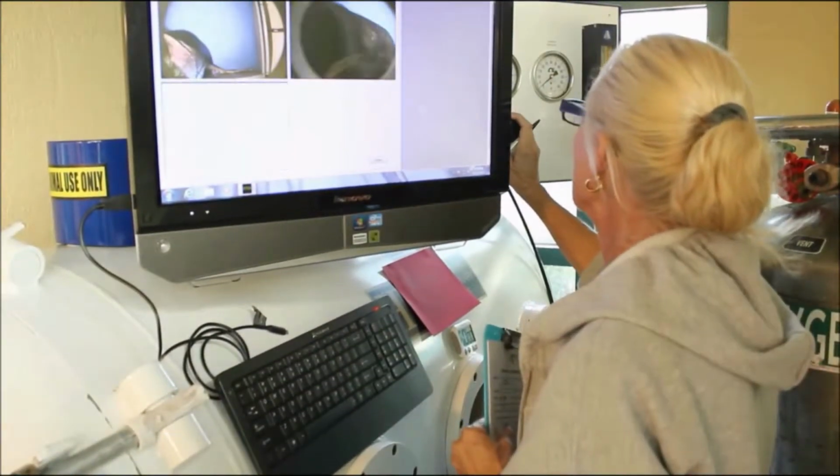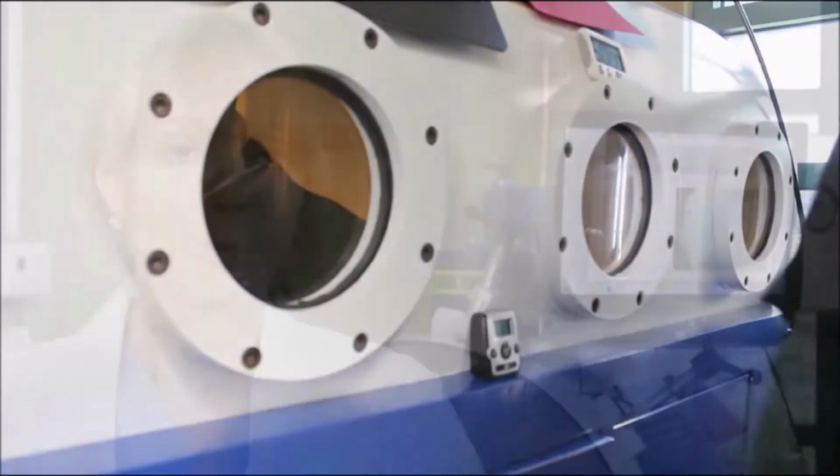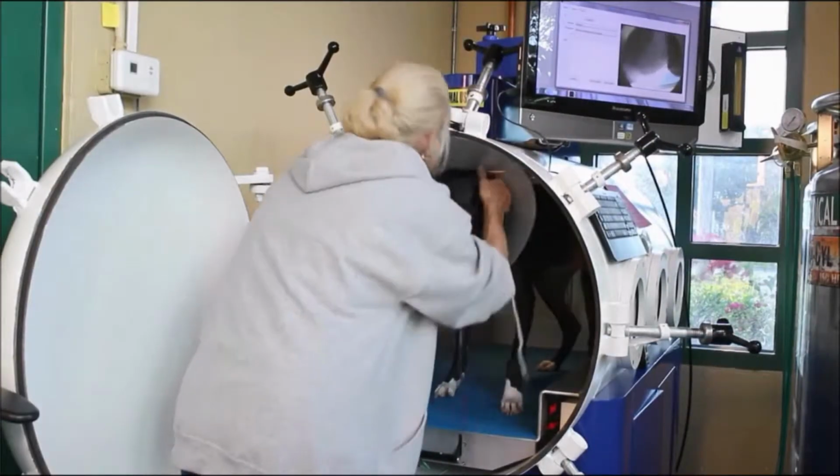Hyperbaric medicine is actually an amazing therapy. What it does is push oxygen in the body, and it brings oxygen in places of our body that the red cells, who normally carry oxygen, cannot get to. So it is sort of super oxygenating the body. With that, you have healing powers that are amazing. The white blood cells are sort of potentiated or superpowered by this oxygen.